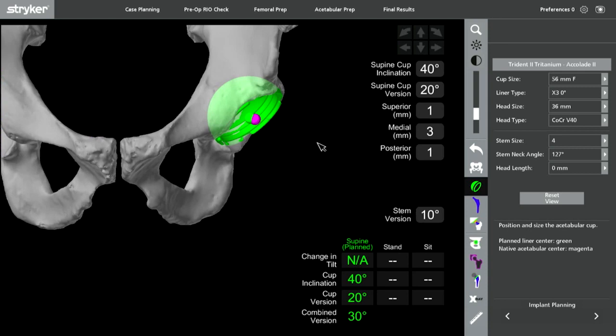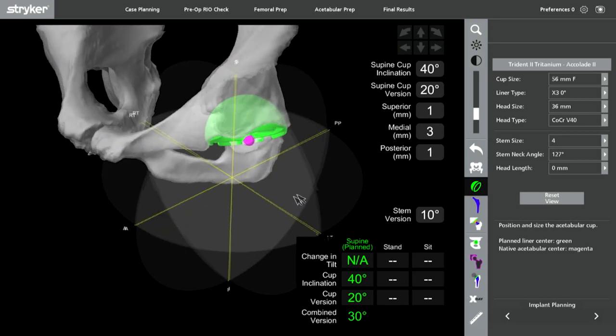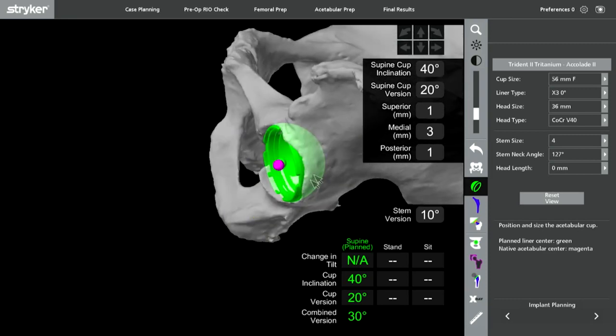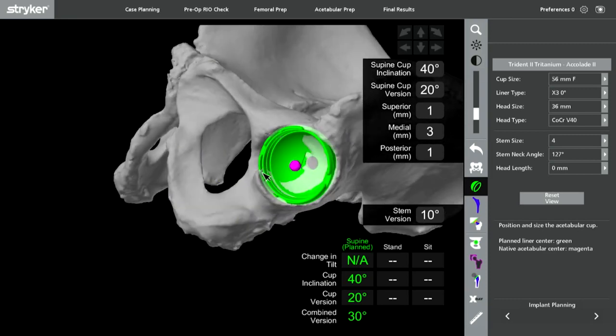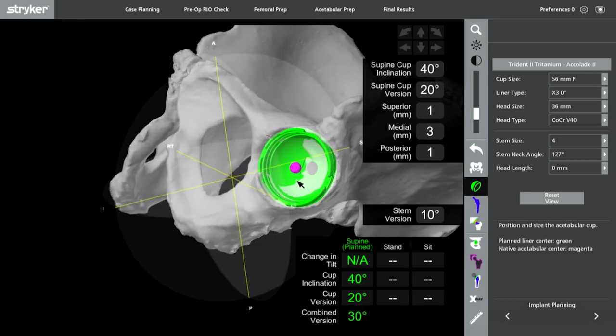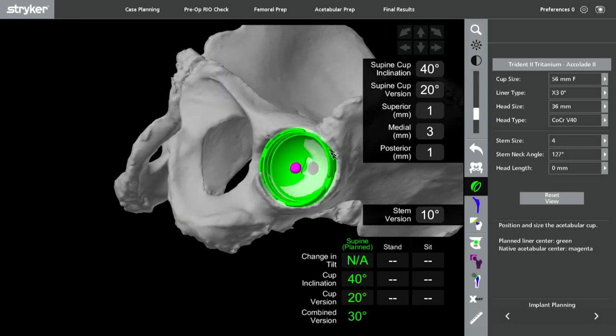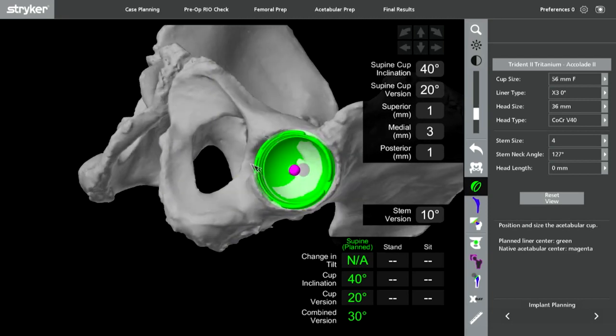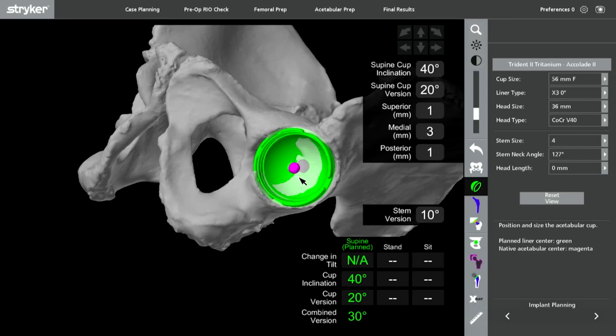Then we look at the three-dimensional model, or the virtual model, with our prosthetic in place, and we can look at it from every angle, and specifically the intraoperative perspective from the anterior approach. And we can see where we may expect to see overhang, where we may expect to see prominent osteophytes that may reinforce and confirm accurate placement of the component.